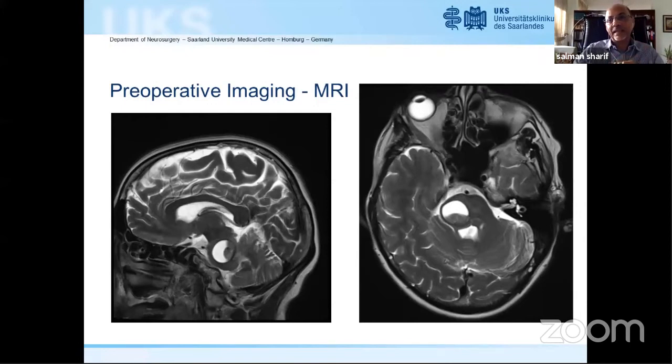So we said there's a little bit of blood there. So what can give rise to blood around the lesion? Okay, so we have the suspicion for hemorrhagic metastasis. So I would recommend to do a CAT scan of the lung and the abdomen to rule out any primary cancer. Do you agree? I mean, this would be an option.